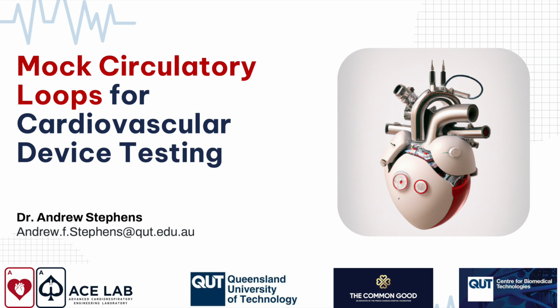So that's pretty cool. This is a mechanical heart valve tester, which is used to generate several million cycles of the valve a day to do accelerated aging testing. Of course, in vitro includes anything grown in a petri dish in cell culturing. We can use benchtop blood reservoirs, and then we can use mock loops of various complexity, including things with anatomical and all the way down to very simple left-sided mock loops.